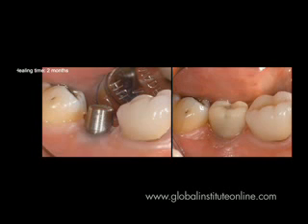Based on good bone quality, based on good implant stability, we'll wait in this patient 2 months for full integration period before we start the final reconstruction. On the left side, you can see how the soft tissue has healed, even got some creeping attachment, and full healthy keratinous gingiva. On the right side, you can see how the temporary was maintained in position for the full 2 months.